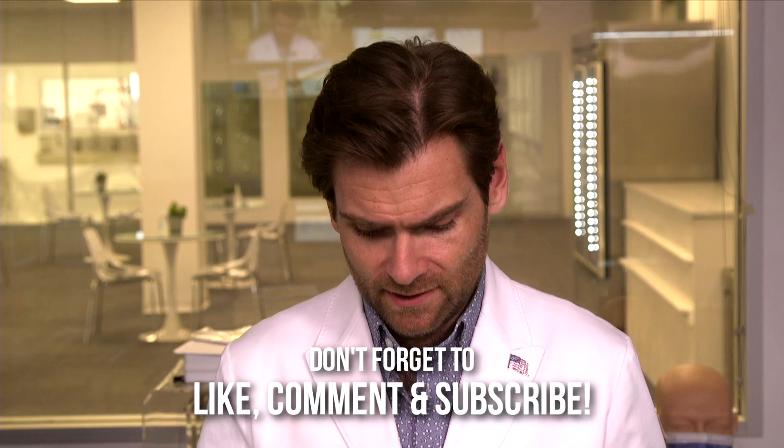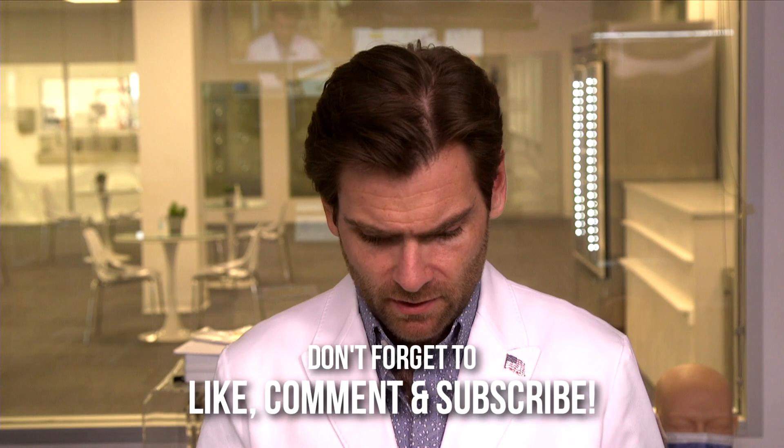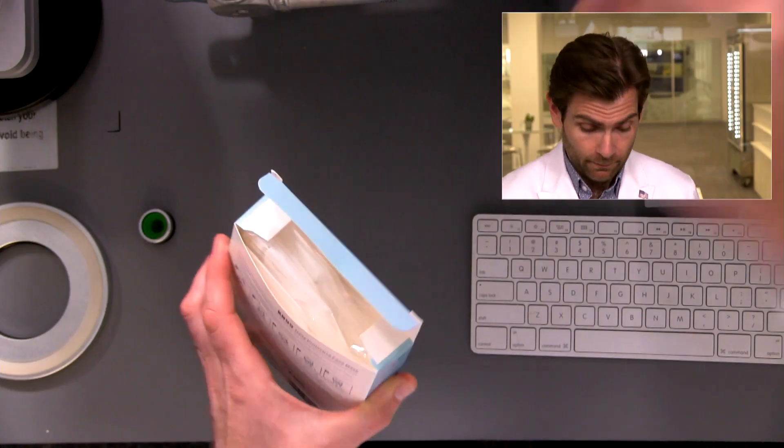Hey everyone, welcome back. We're testing every single mask on Amazon. Today I'm looking at the Daily Protective Face Mask KN95 — also made by a company called Prim Care. Let's dive into this thing and see what happens.